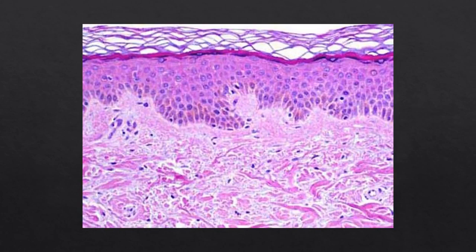Hematoxylin is the first chemical used in the stain. Hematoxylin is responsible for staining the nucleus of all cells blue. Hematoxylin by itself does not produce any staining. Rather, treatment with other chemicals and ions leads to the final stain.